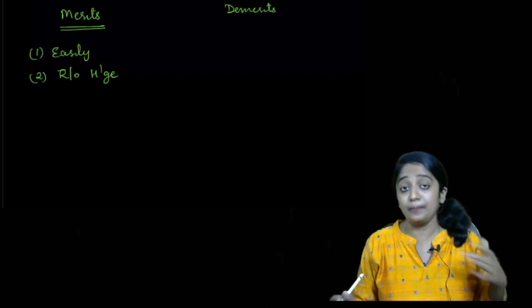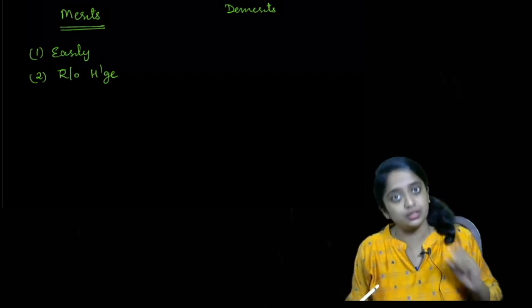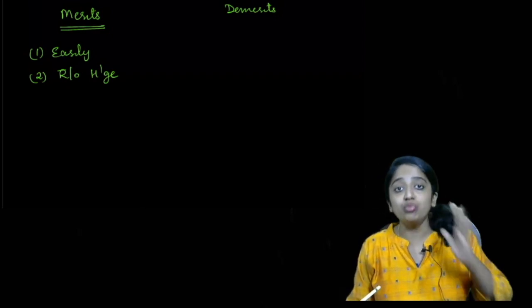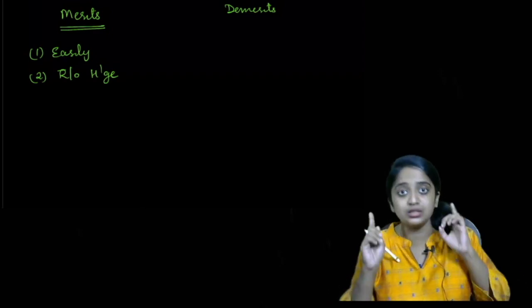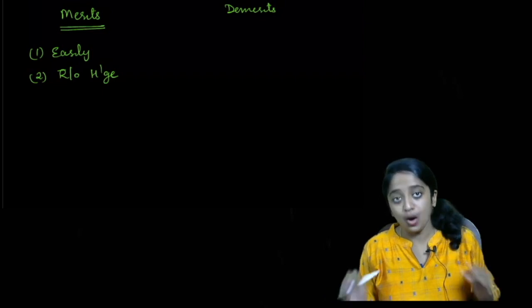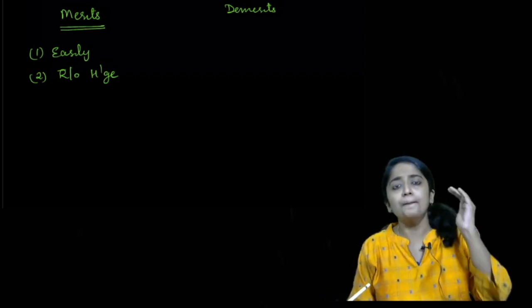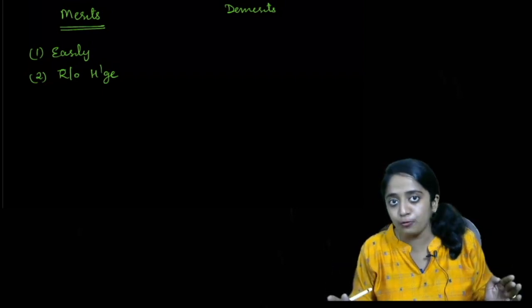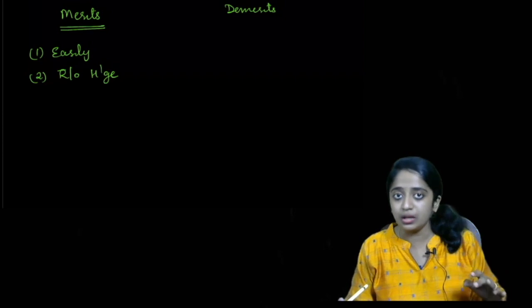Somebody may ask, why not MRI? MRI is a very time-consuming process. And to rule out hemorrhage, you need multiple sequences. Not just one image is enough. You have to obtain multiple sequences. Only then can you confirm that it's a bleed, because a bleed has various morphologies in various sequences in MRI. So, readily available to rule out hemorrhage, it is CT.